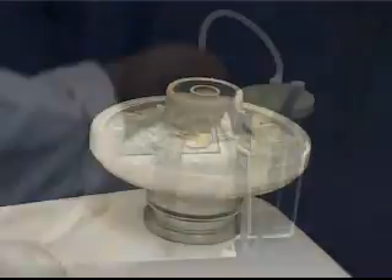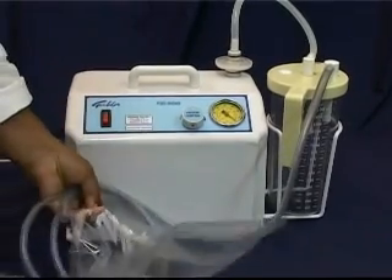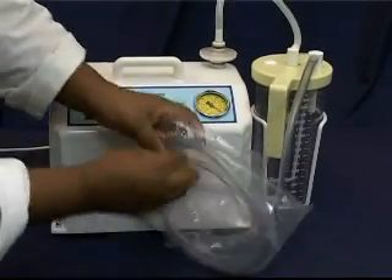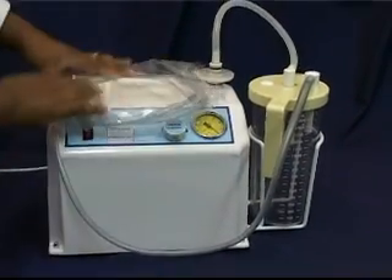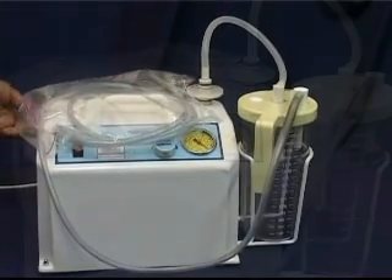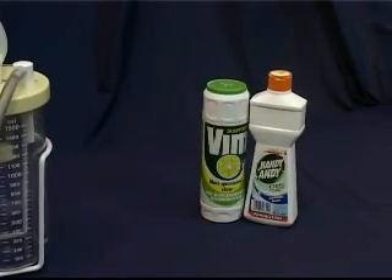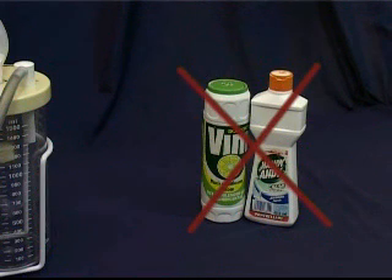Change the filter when any discolouring is visible. Wind the tubing around the pump or place it in a clean bag. Remember that most bottle lids, bottles and tubing can be autoclaved, so send them to be sterilized at least once a month or after use on an infective case. Note that alkaline detergents and solvent-based cleaning agents should not be used for disinfection and cleaning.